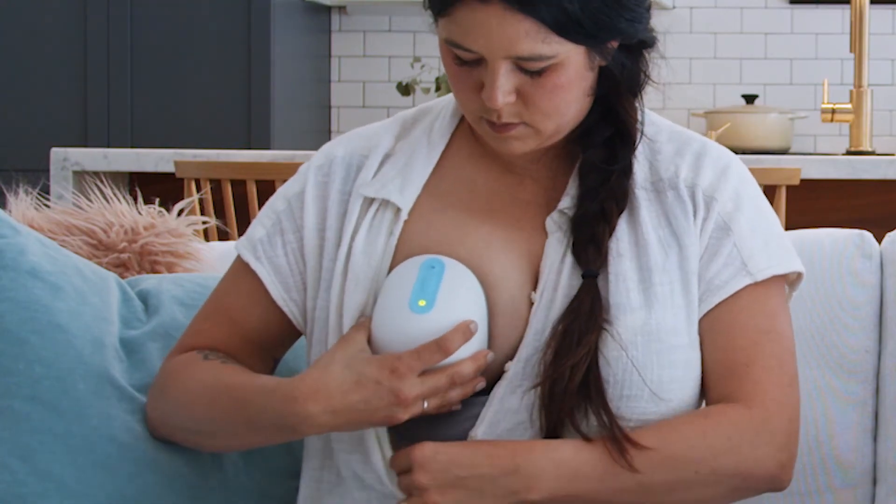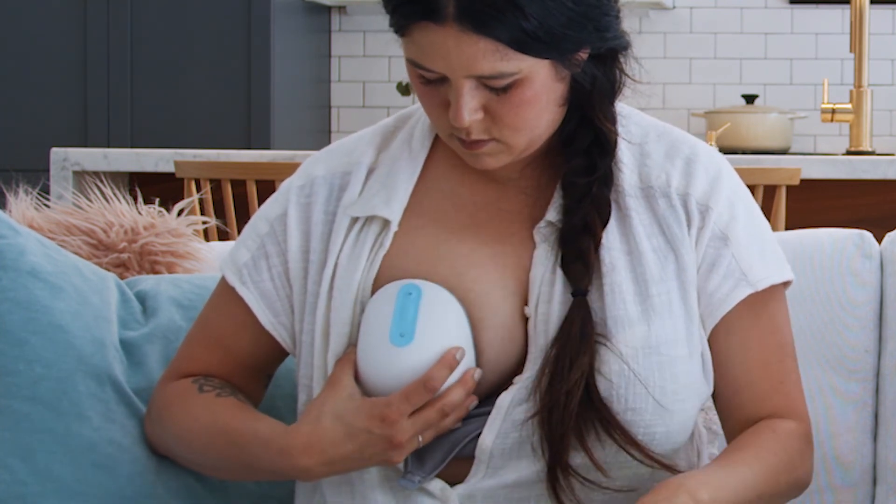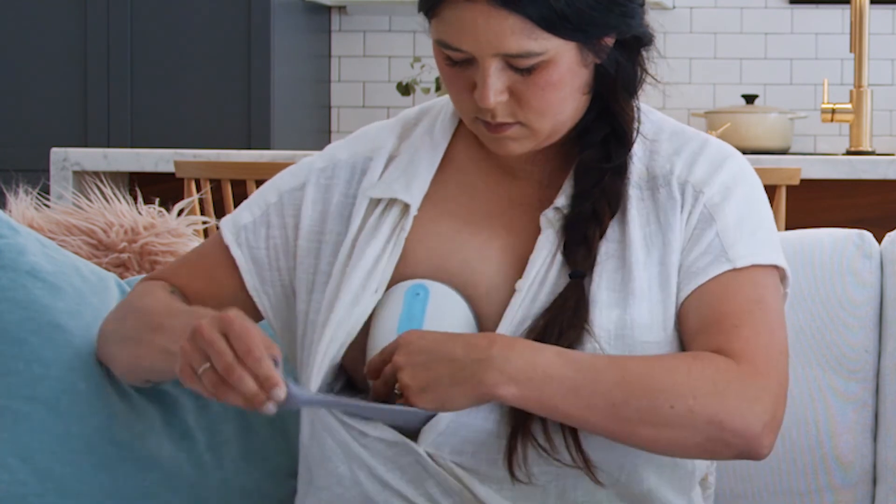And lastly, when you press play, you should hold Willow firmly to your breast and wait to close your bra until you're in stimulation phase. It's about 10 seconds.